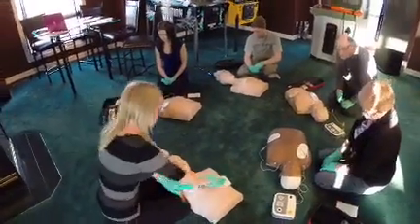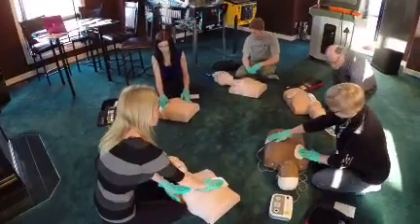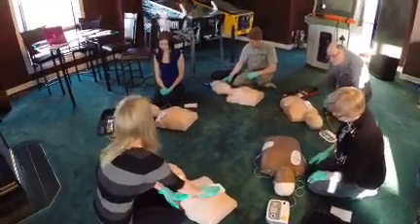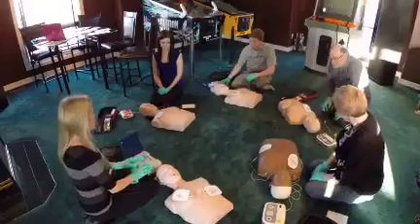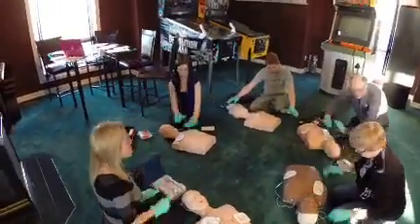Okay. Press the pad firmly on the skin. Press them firmly on there so that they're stuck good. Do not touch the patient. Now, when it says analyzing heart rhythm, do not touch, remember, go clear, do not touch the patient.